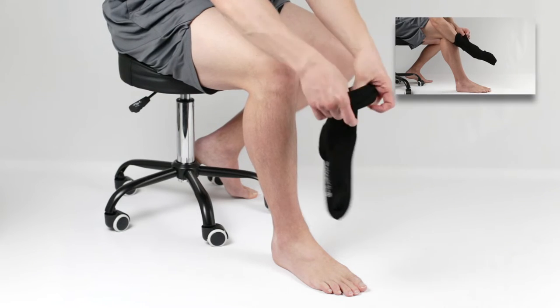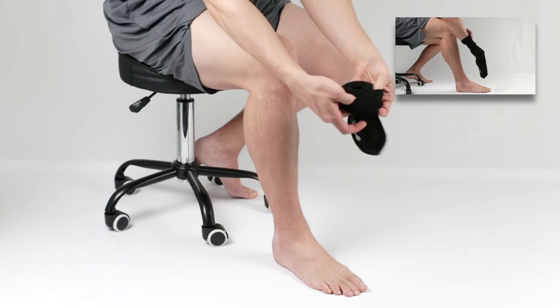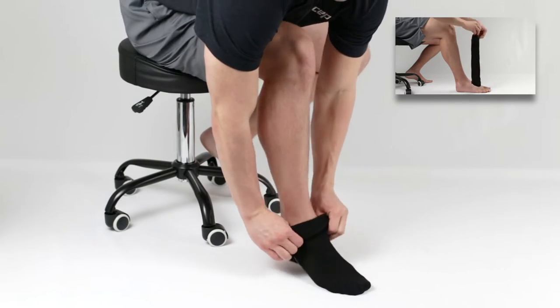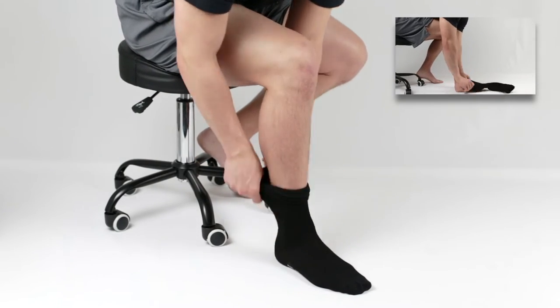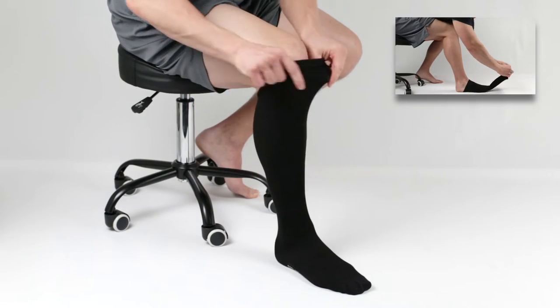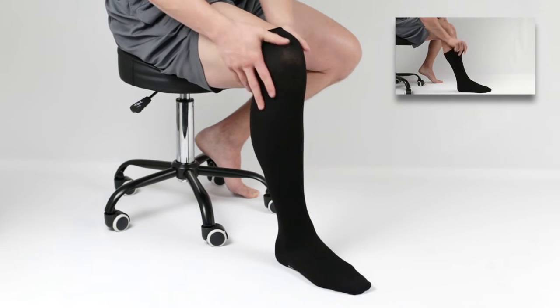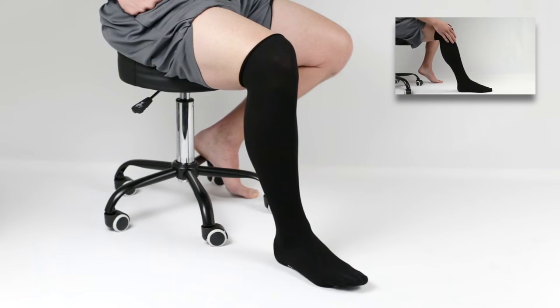Apply the CircAid Compressive Undersock by pulling it over your foot and up the leg to the knee. Some find it easier to apply by sliding your hand into the sock and turning it inside out at the ankle before sliding onto the foot. Make sure there are no wrinkles in the CircAid Compressive Undersock.